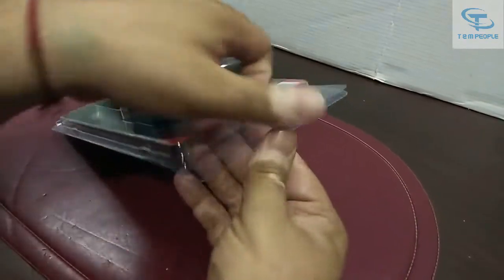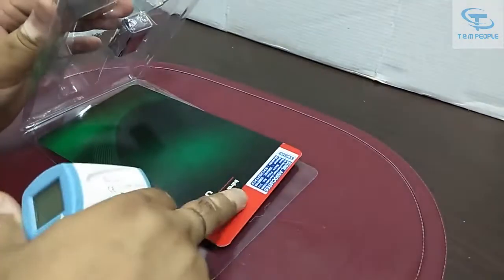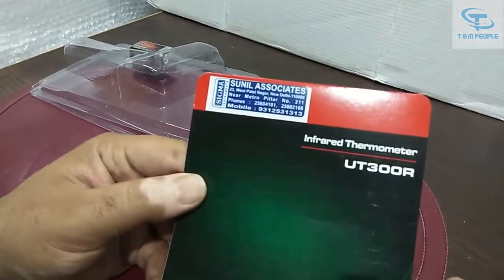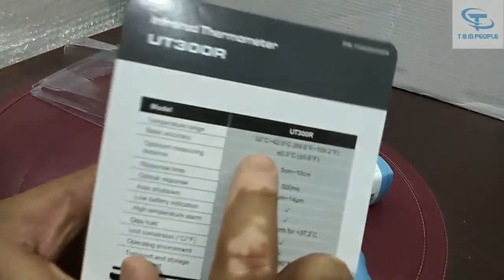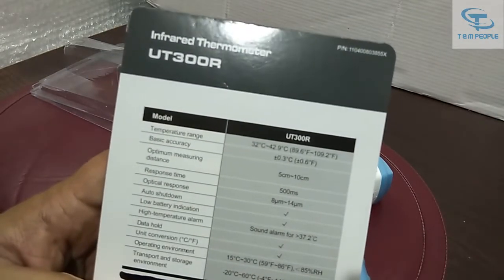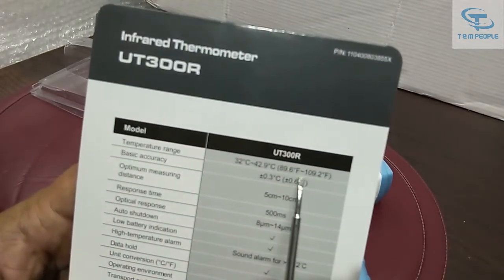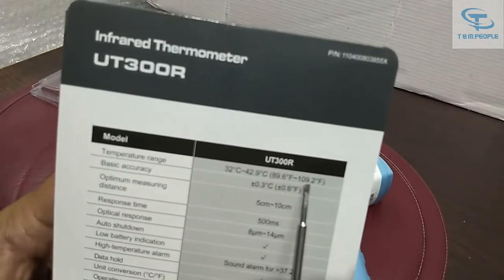I'm opening up this box and you can see all the details and the manufacturer labels and addresses already given on the instrument. You can see the details of Sunil and Sigma are given, and the range of this instrument is shown. The temperature range in degree centigrade is 32.2 degrees Celsius to 42.9 degrees Celsius, and in Fahrenheit it is 89.6 to 109.2.